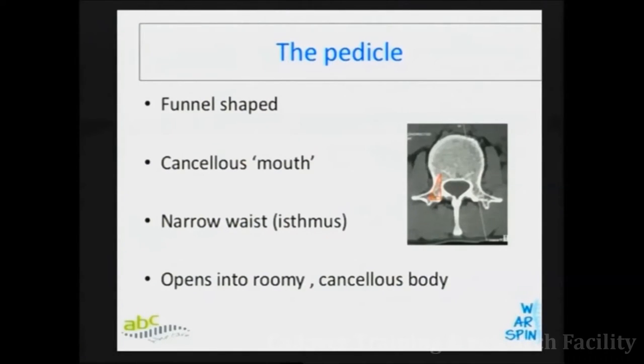This is how the funnel of the pedicle looks: there is a very big floor and you have to figure out where the head of this pedicle will be, and that cones into a relatively narrow path — about 7-8 millimetres, sometimes even more. It's relatively narrow because the screw you're aiming to put is a 6mm screw, so it becomes cut to cut. But for a probe it's not that narrow. Once you pass that initial 1.5 centimetres — 15-18 millimetres — it's a big receptacle of bone and you can't miss it. So the trick is just to get your first centimetre and a half through.